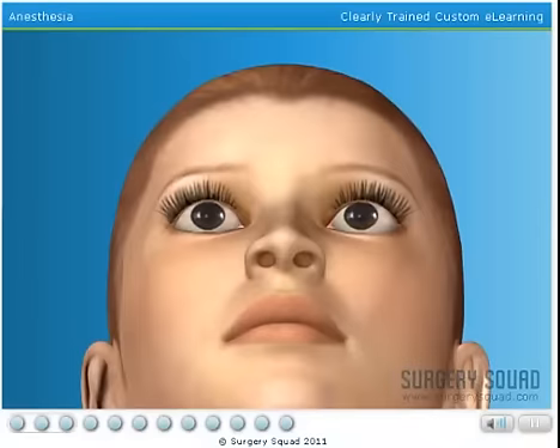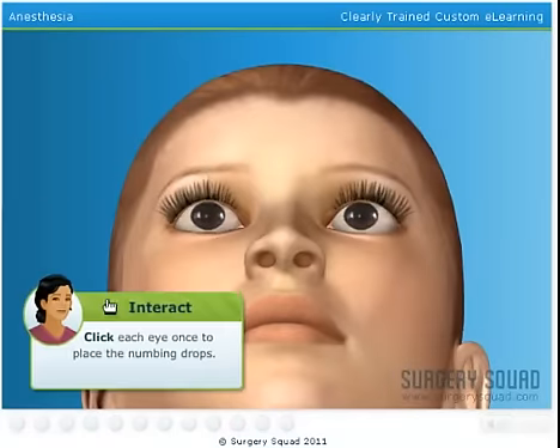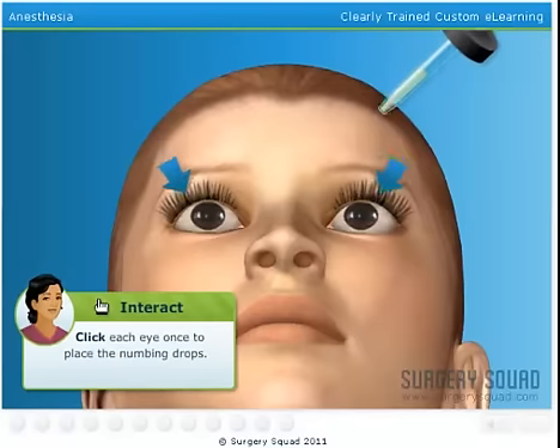We want to make this procedure as pain-free as possible, so we'll use drops to numb the eye. Can you place a few drops into her eyes?